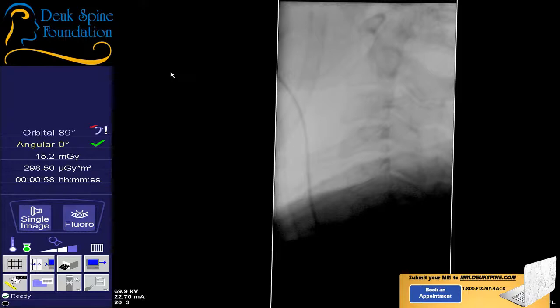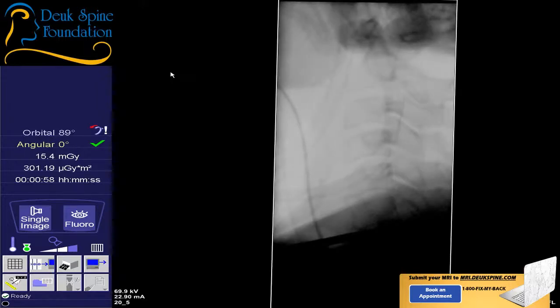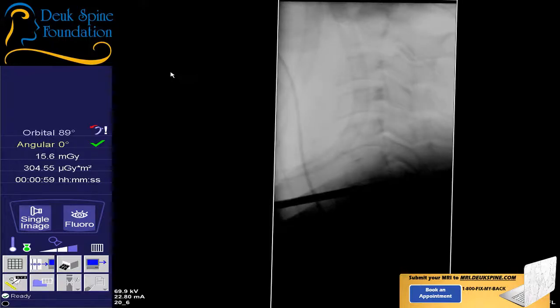Yeah, go ahead. Get the neck. Tell us when you have the neck and the head. You good? Okay. All right. Shoulders. Shot. All right. Give me a little more south. Shot. All right. Just stay there. That's tough, but I think we're okay.